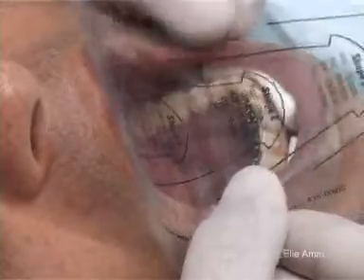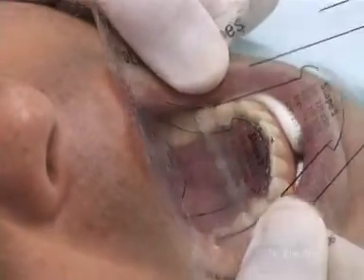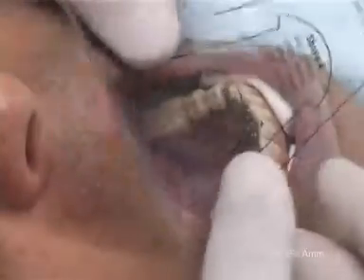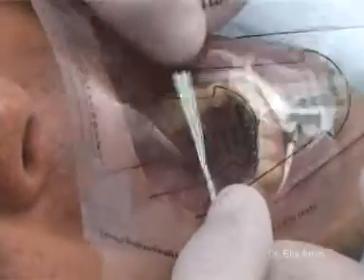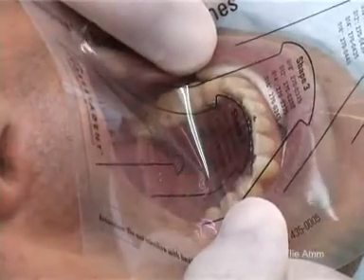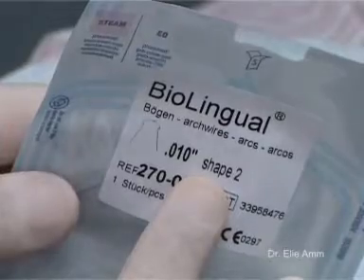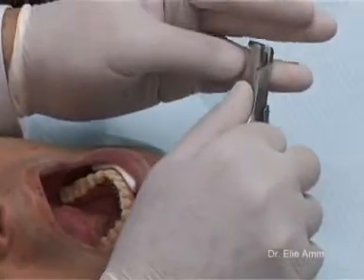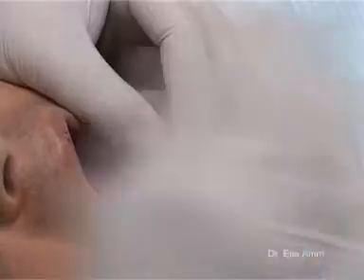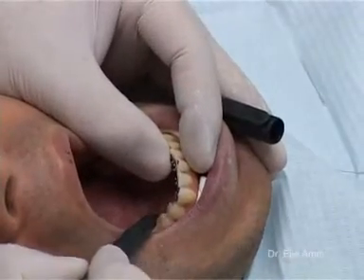With a photocopy on an acetate paper of the lingual arch form template, we can choose the specific arch form of the patient by superimposing it to the wire slot in the mouth of the patient. This is a shape 2 arch form. We choose a 0.010 shape 2 biolingual arch wire from Forestadent, cut the excess length, and mark the distal portion to be bent toward the teeth to avoid poking the tongue.